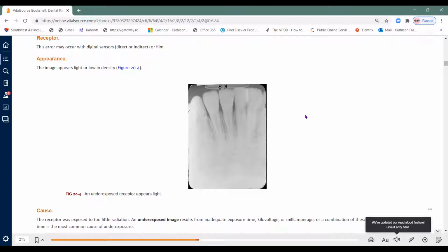Her bone is starting to break down. So if I had a little 80-year-old patient here, I would probably set it for a child instead of an adult, because you also have to go by the size of the patient. An adult setting on a tiny old lady may be too much for her.